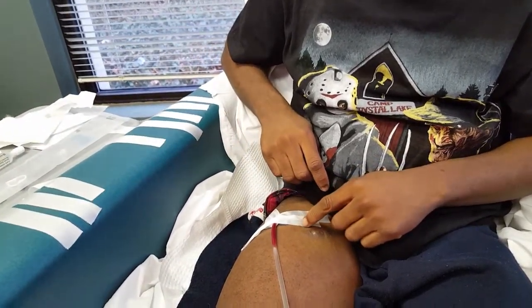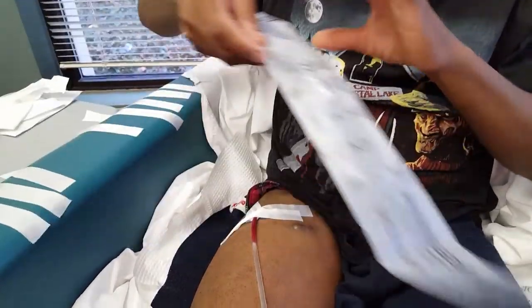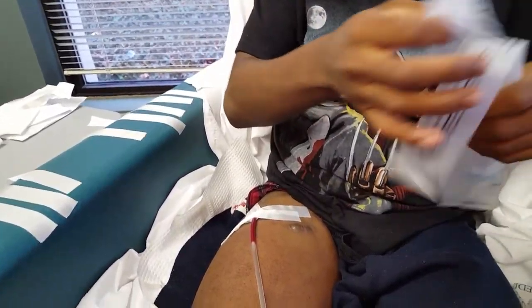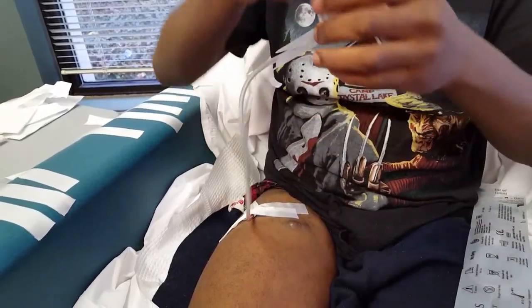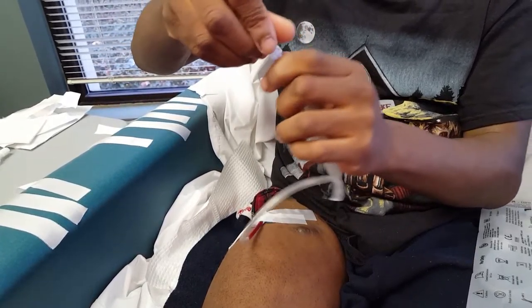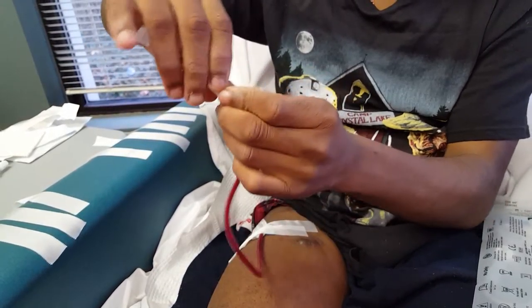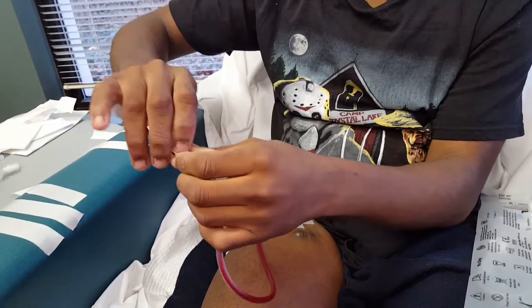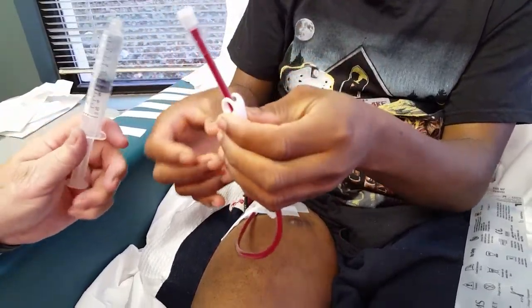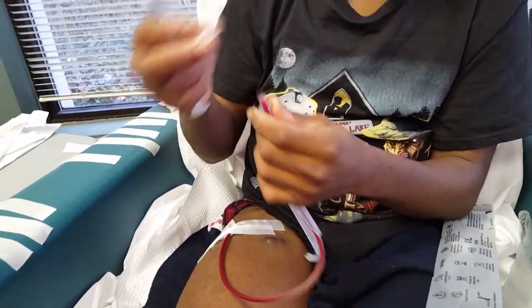We're going to stick on this side. Well, make up your mind. I'm going to take this one. Are you supposed to flush that one first? Yep. Tell them what you're doing. All right, I'm returning this, and I clamp this. You're priming the line. Well, flush it, or is it clamped? I got it clamped. Yes, we only make that mistake once.